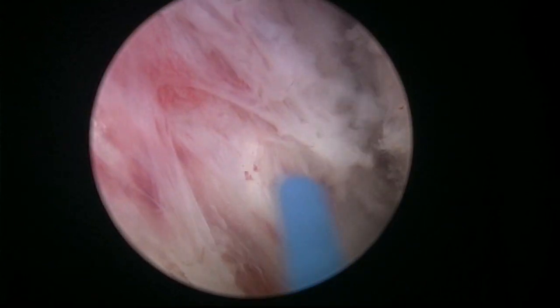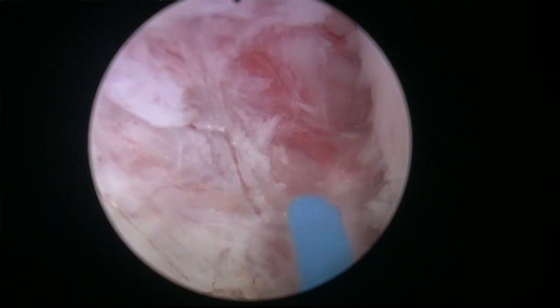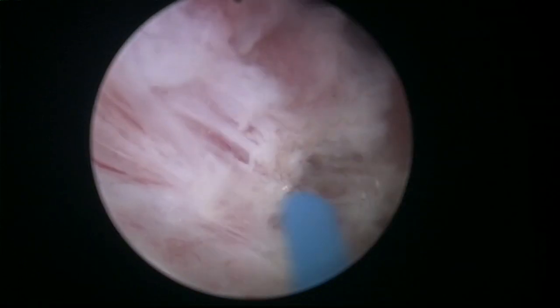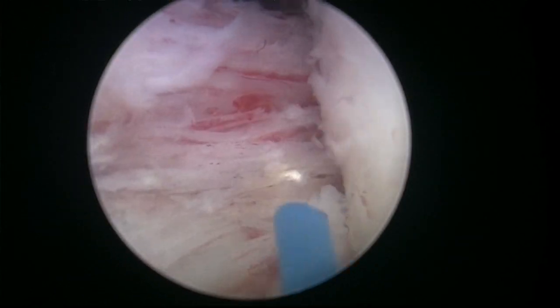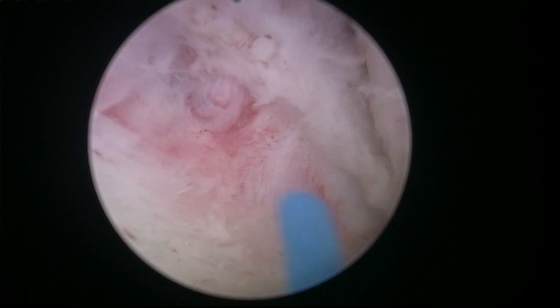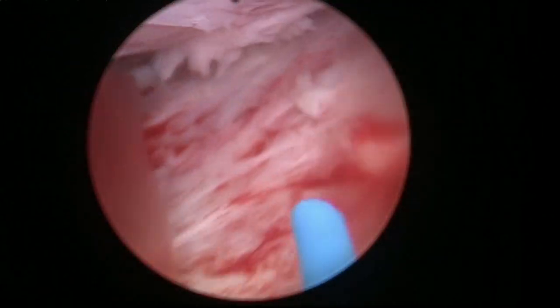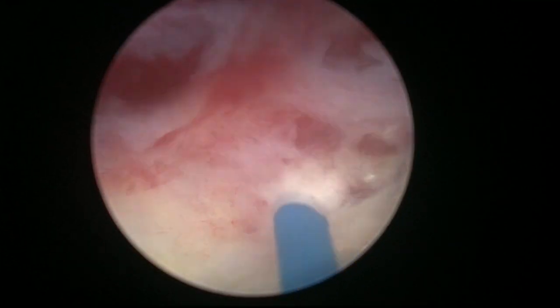It never looks the same. I think some planes are more inflammatory, some planes are a little bit less inflammatory. Sometimes we see a beautiful interface between the adenoma and the capsule. Here I wouldn't go inside, because behind this, there's the UO. So just going to do some hemostasis of this area, get the vessels. Okay, it's somewhat better. Let's see the posterior aspect. Sometimes we don't pay too much attention to this posterior aspect, but sometimes there are some bleeders here as well.